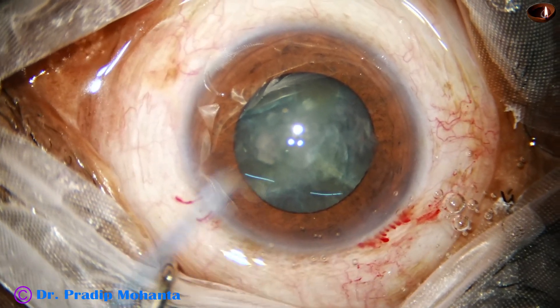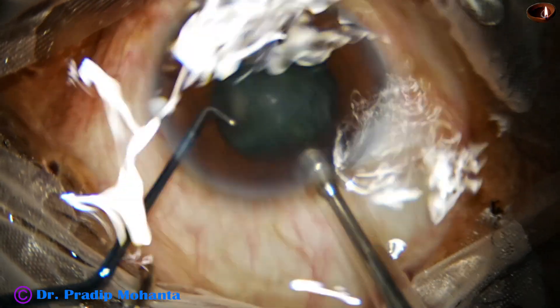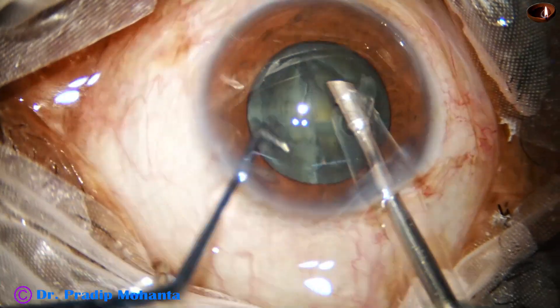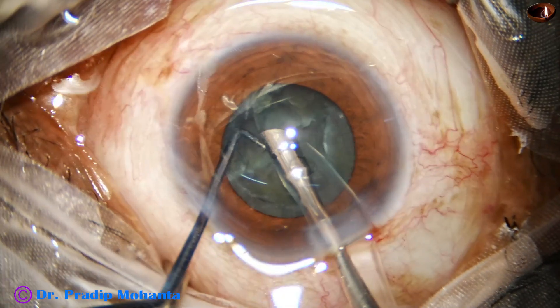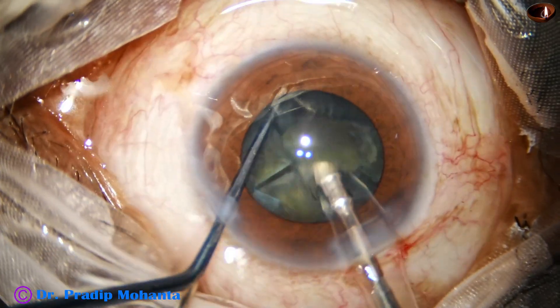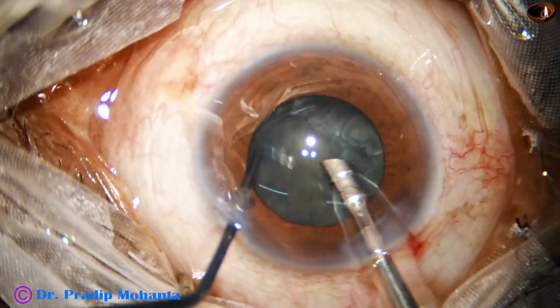If we try to do any other technique, it is going to take longer time. If we try to chop this nucleus, we may end up creating a bowl. This is the technique of my choice to break off the nucleus into fragments and then emulsify the pieces.